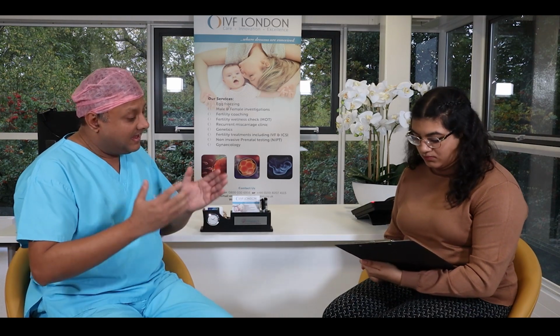And at the end, it reels a beautiful video of all the time points that that embryo has undergone in terms of division. And the amount of information that embryologists get is amazing, and there's a lot of information which enables the embryologist to make a very fine-tuned decision about which embryos to select or deselect for embryo transfer. So you're talking about the information that an embryoscope provides. What precisely do you look for in an embryo using an embryoscope that's not available to you otherwise?